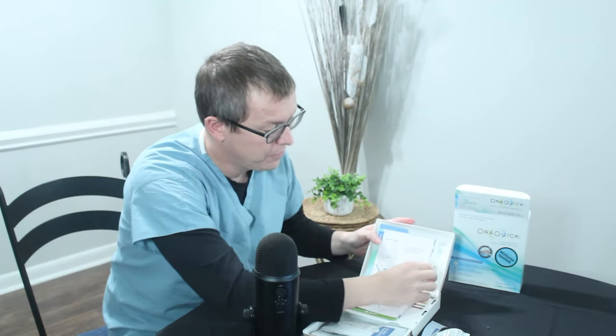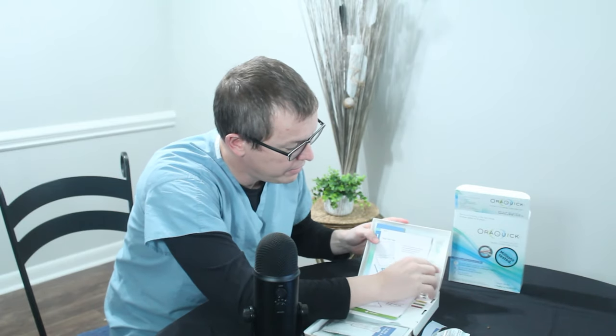There is liquid in here. You have to make sure you do not spill this. You're not twisting this cap — you're trying to pop it off. Do not spill this. Do not drink this. That is not part of the test. You're going to pop this cap off, and once that's off, you insert that here in the test kit.